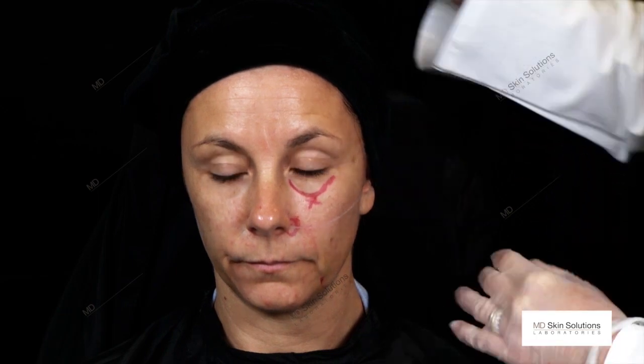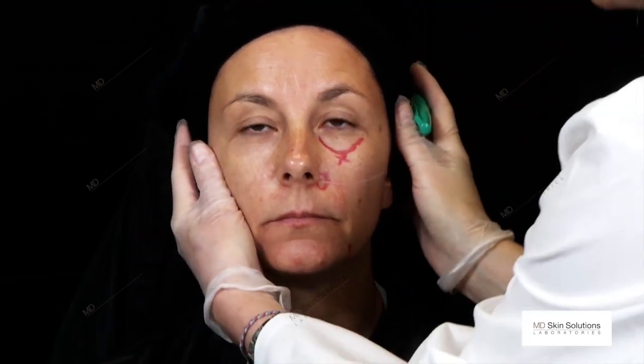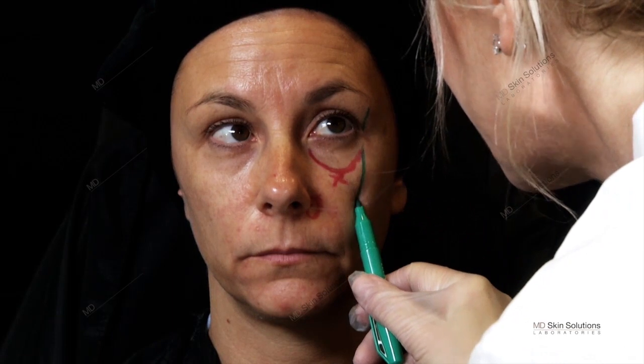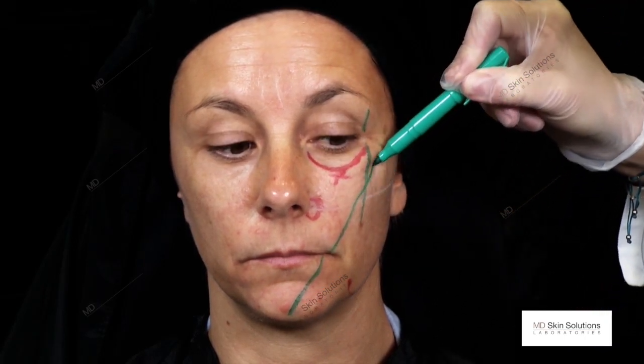The next lines we draw are the strategic lines to find the entry points. In her, we need one entry point for her cheek area. We do find this by marking the lateral orbit going down, and where this line crosses the line which comes from the mid-mentum, crosses the corner of the mouth and comes up to the cheek area.